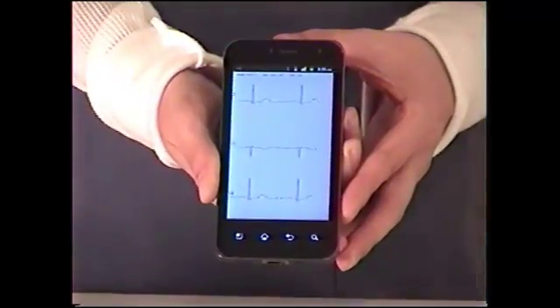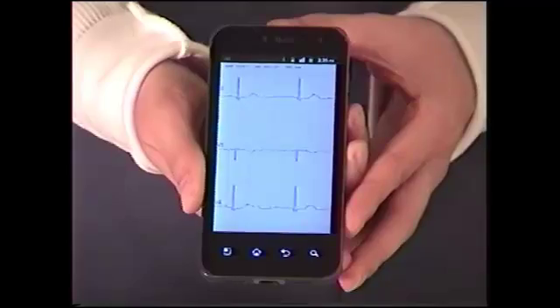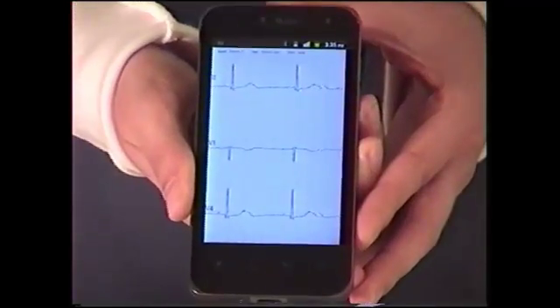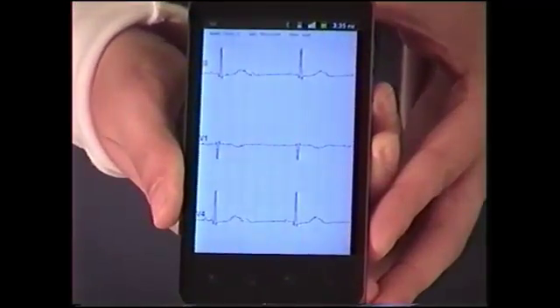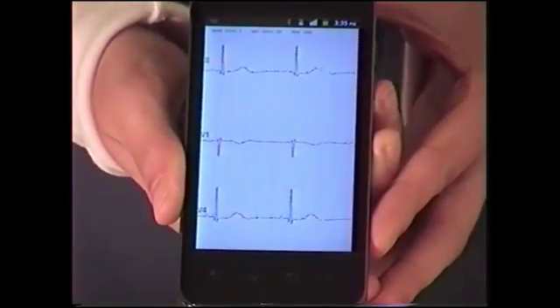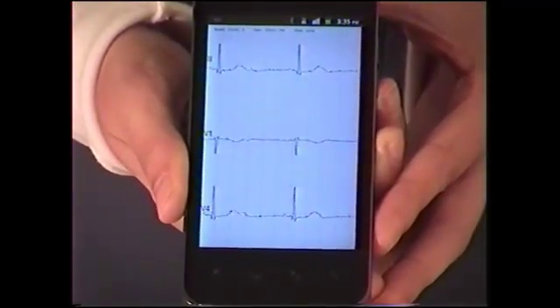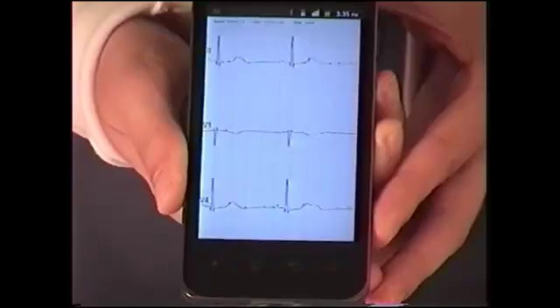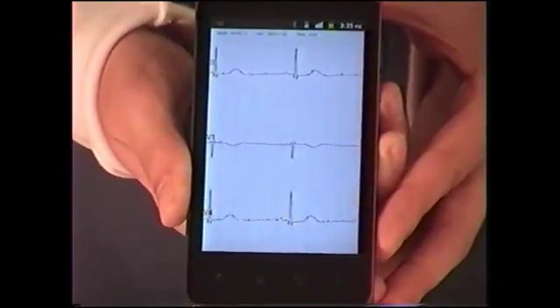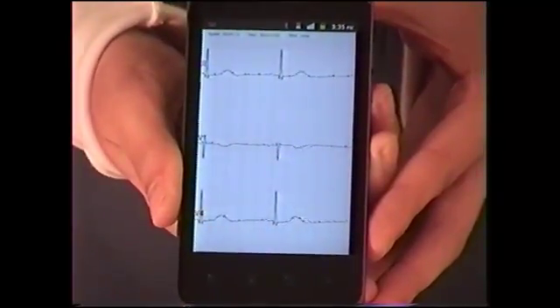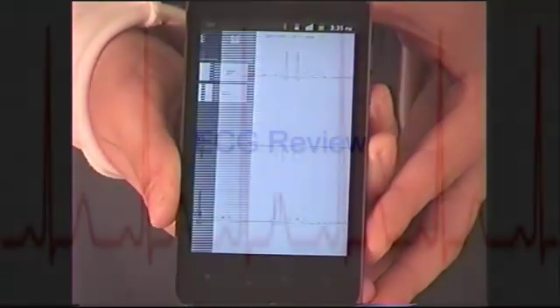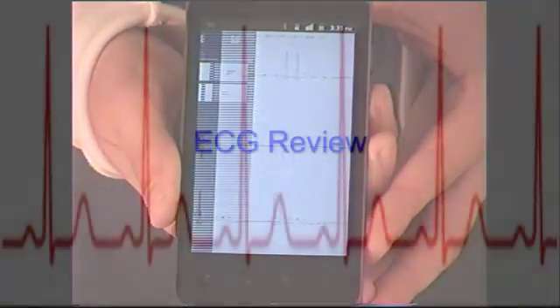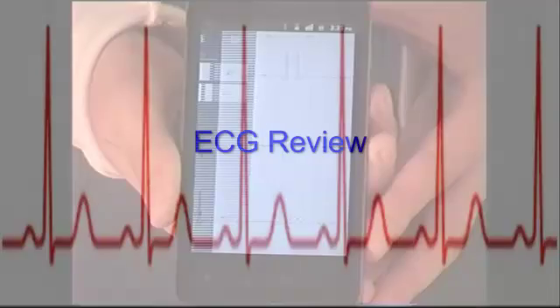As you can see, we are collecting an ECG to our Android phone. Although it is displaying three leads, so as not to cramp the screen, we are going to collect all 12 leads of data, which we will display when we review the ECG.